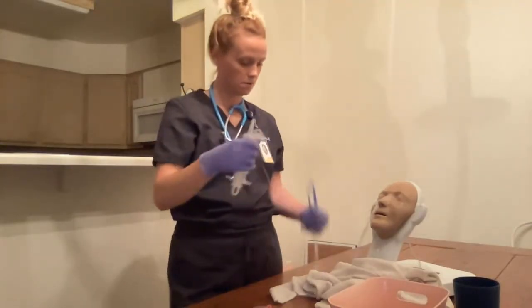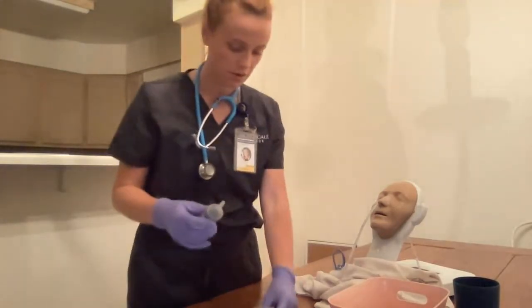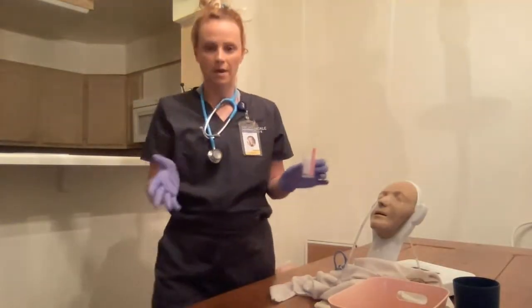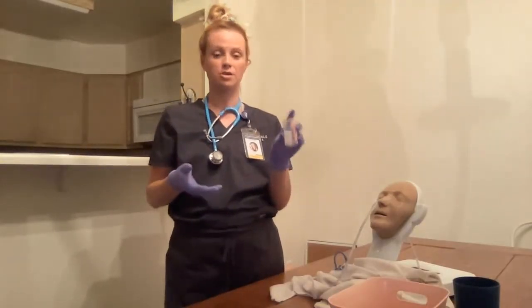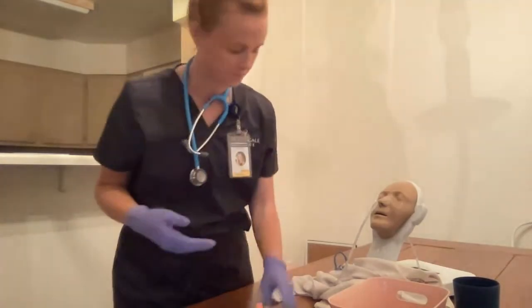Clamp. All right, I'm going to swish it around just a little bit. Put it in my specimen cup here. Okay. Put the pH indicator inside. Depending on facilities, it's either 1 to 4 or 1 to 5 for stomach content pH. It is between those limits, so it is in the correct placement.